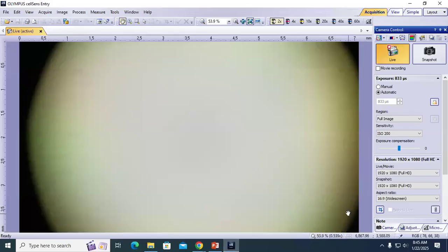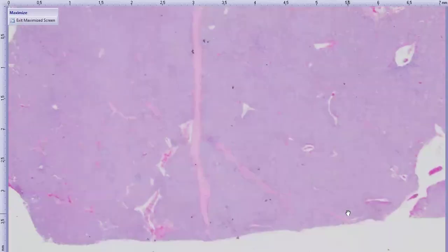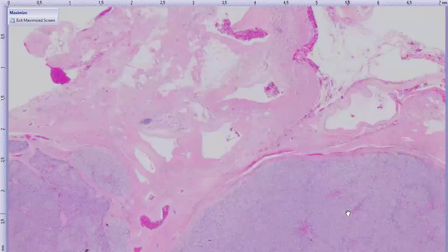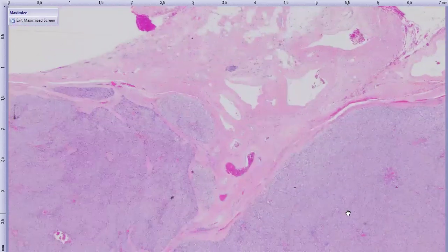We'll switch to the histopath, and I'm pretty much just going to show you the mass in the orbit. We basically had this mass submitted separate from the globe, and it looks pretty much the same throughout. So this was a tan mass, grossly, and then histologically it's pretty highly cellular. Its edges are pretty well demarcated. It's not really encapsulated, maybe a bit of a collagenous pseudocapsule, but pretty well demarcated, with a lobular look from low magnification.